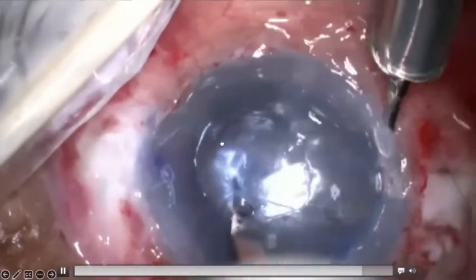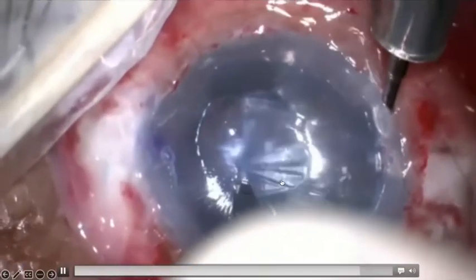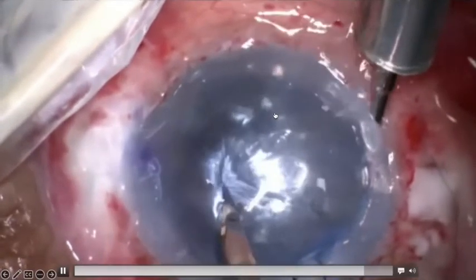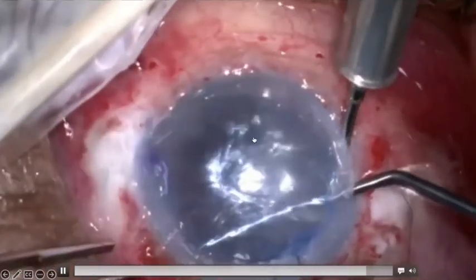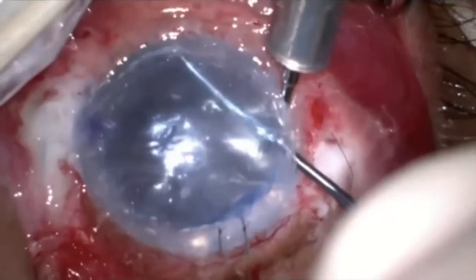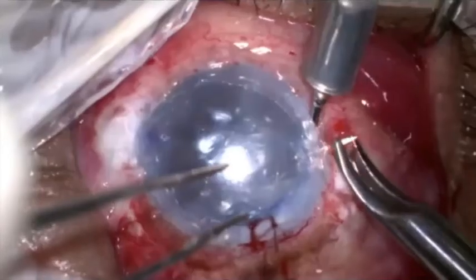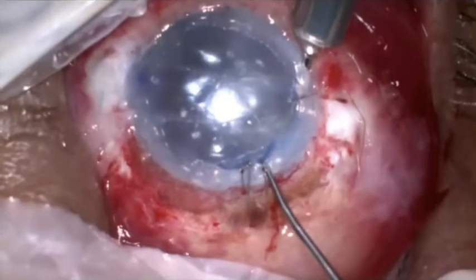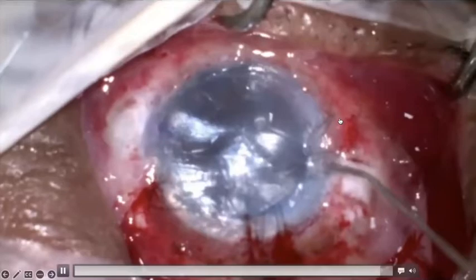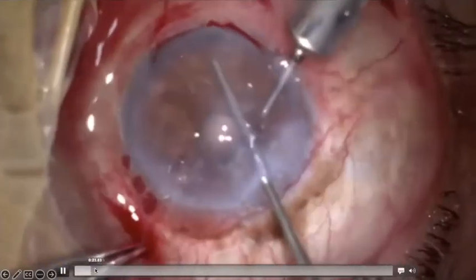Now you can see that there's a little pocket of fluid there, and you saw just now that the pocket of fluid can be released using the air pump, just like you do in Descemet. But this was the only time this ever happened to me. You can also massage the pocket of fluid to the sides with the air pump, because that will allow you to push the fluid away. If that doesn't work, you could possibly put a transcorneal incision to drain that fluid. But that really is quite rare, as I said, and it was the only time that it's happened to me in the huge number of cases that I've done.